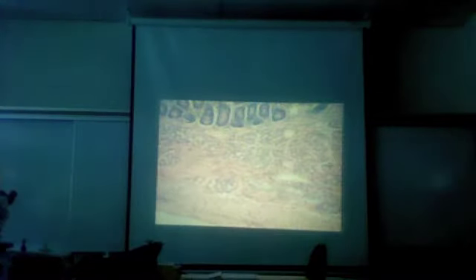What about all these little bumpity bumps over here? What kind of tissue is that? Or not tissue, but what would be the structure? A gland. Remember we were talking about bumpity bumps? There's a better picture of bumpity bumps. See, this is all gland in here. Like little clouds, bumpy clouds or something from a low magnification. When you get up close, then you see the acinar cells and their little clusters, but just from a distance, it looks like little bumpy clouds.